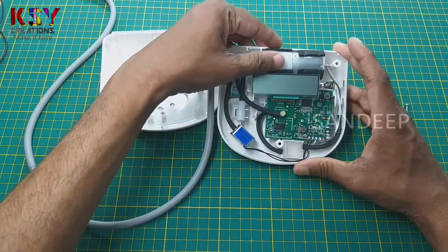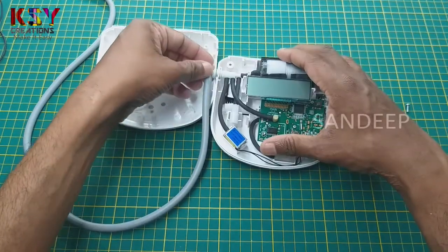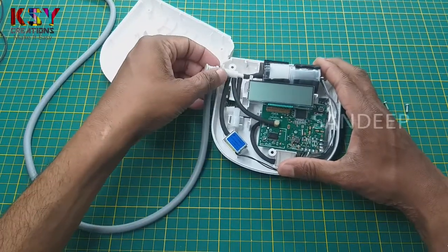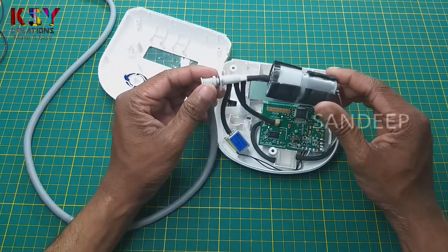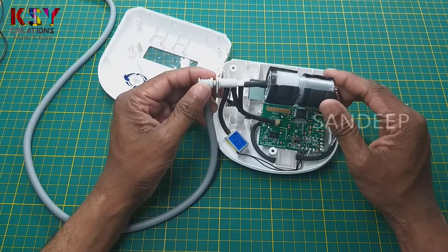So this is the thing what we need. There are many pipes in this. This is the air pump. There are two pipes.